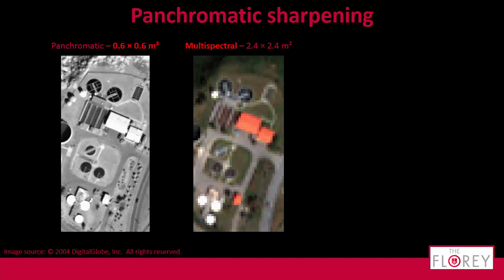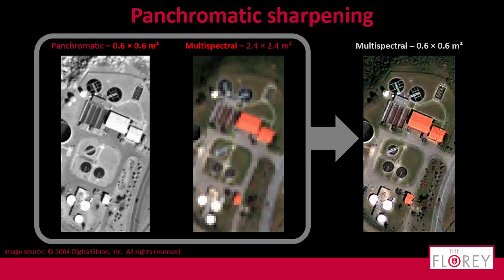This is exactly the same problem we're having now in our domain, but they already came up with a solution. They just merge the two in a way that I will more or less explain for my data, and this is what you see then on Google Maps. You see a high-resolution color image, but it actually came from those 2 images that you saw before. Really, that's what they do in practice.